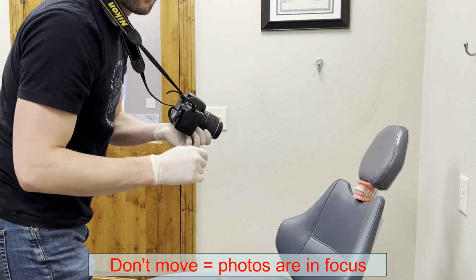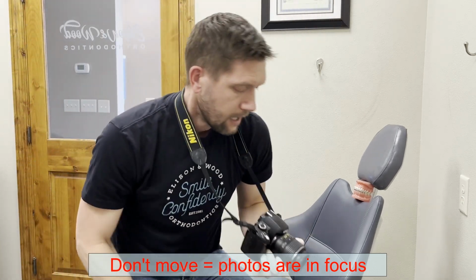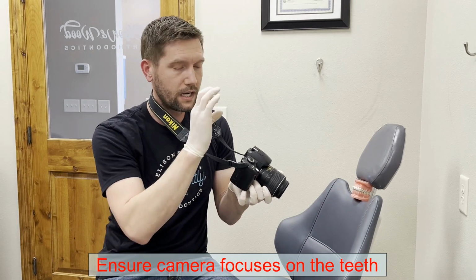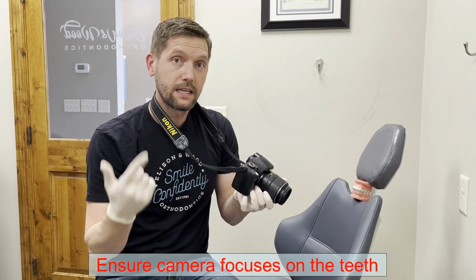The second most important thing is inside the little viewfinder, you'll see some little squares or boxes like this.